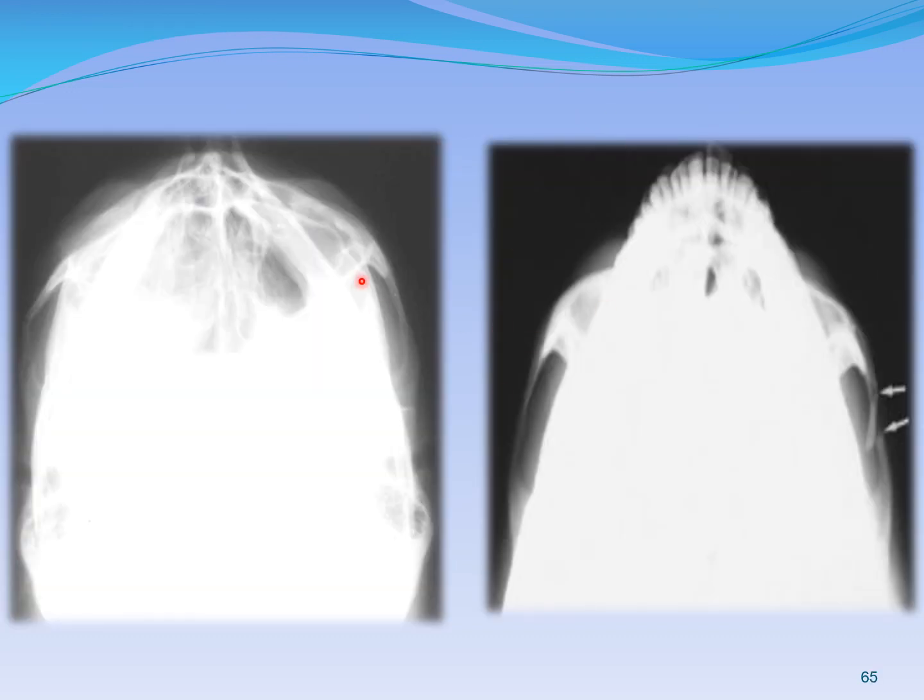So this is how an SMV jug handle view appears to us. This area, what we could see clearly in an SMV, that is the mandible, the skull, or all these areas, are not properly seen in this radiograph. Why? Because we have reduced the exposure by 1/3. So you can only see the zygomatic arches.